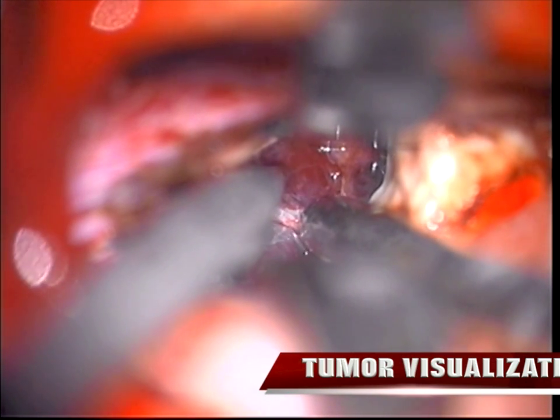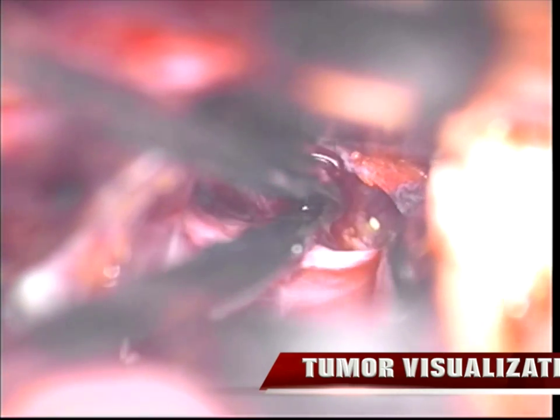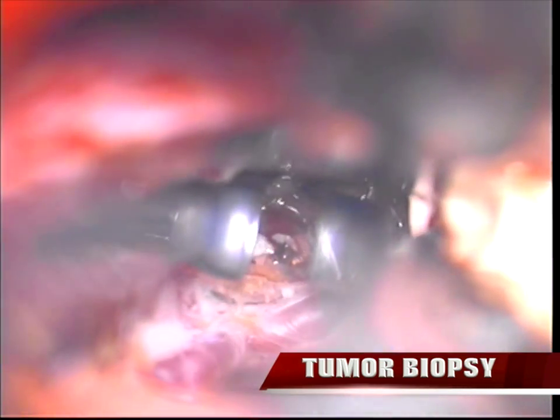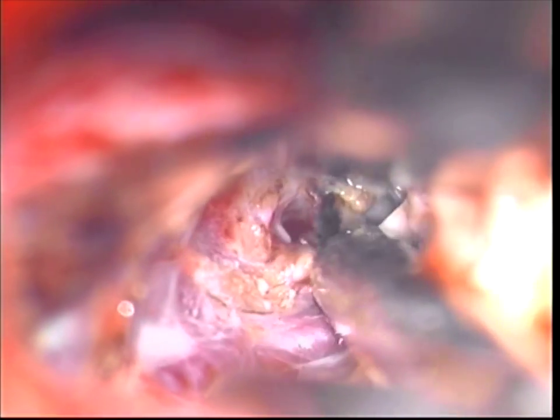At this stage, we have our first look at the tumor. You can see it's a reddish vascular lesion, and we're quite deep there. Now you can actually see the tumor itself. We're bipolar on the surface. Multiple biopsies are taken from here. I'll get a frozen, but when you can remove the whole thing, I prefer doing that. So here, we're taking a bigger piece of tissue out — a nice big piece for permanent and frozen sections.